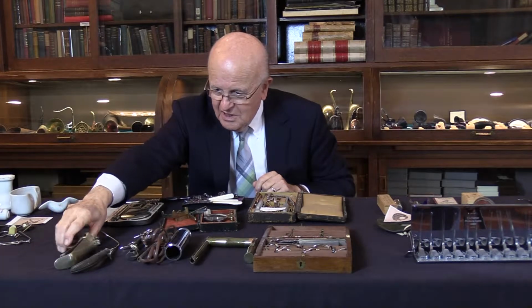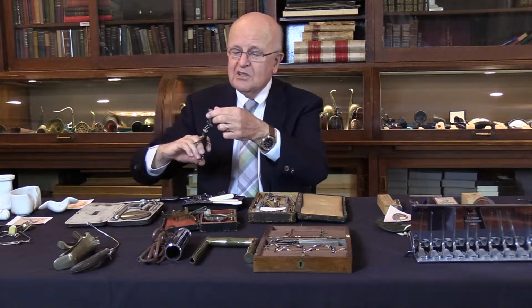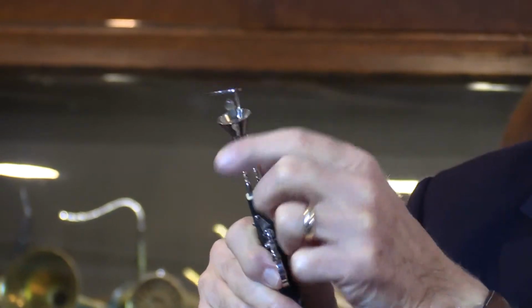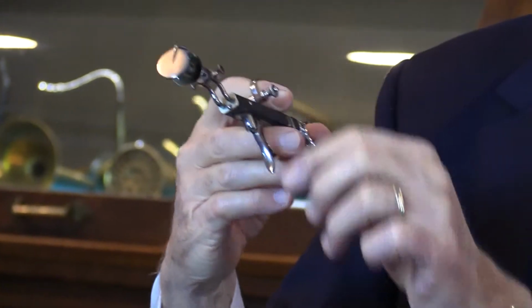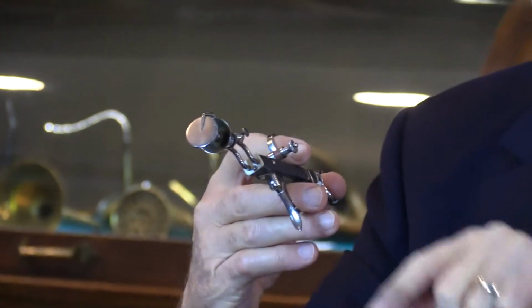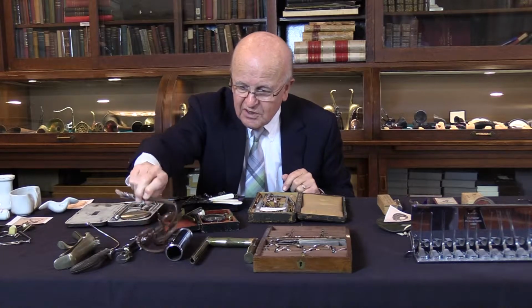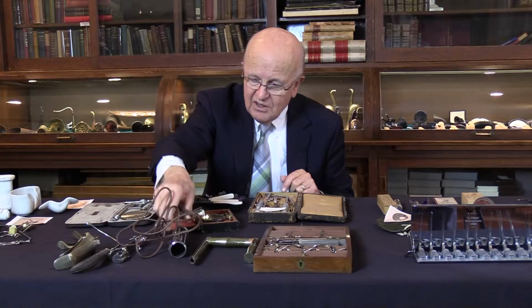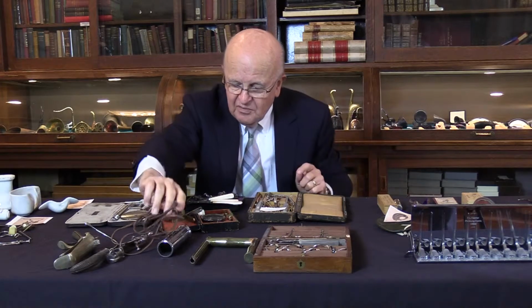Along the same principle, this is another one that has the laryngeal mirror here. They have the light source here, so you can look and you can change the angle of the mirror, and you will have direct light hitting the mirror and reflecting it to the larynx. And this is the same principle here, but it's portable. This is where the battery sits, and you can use this with the light hitting the mirror directly.